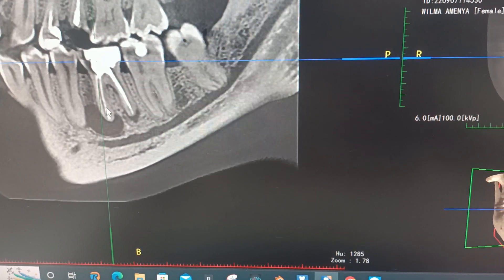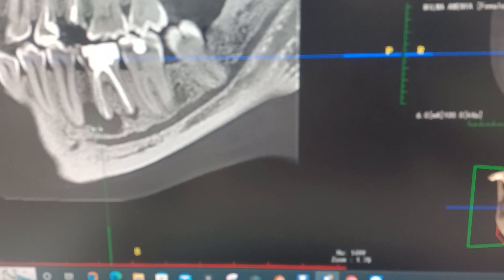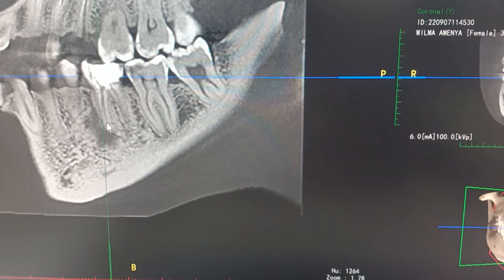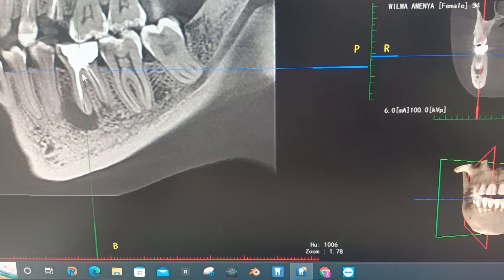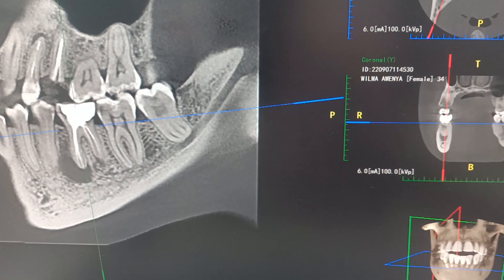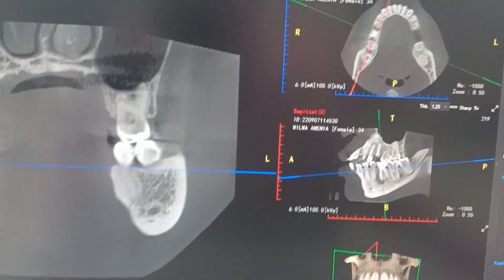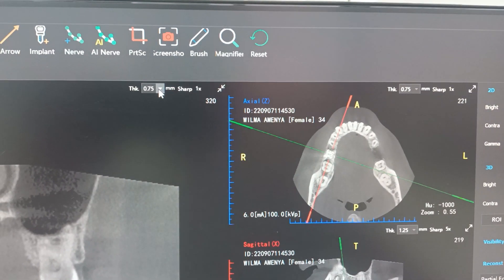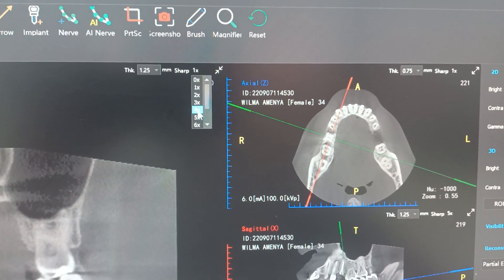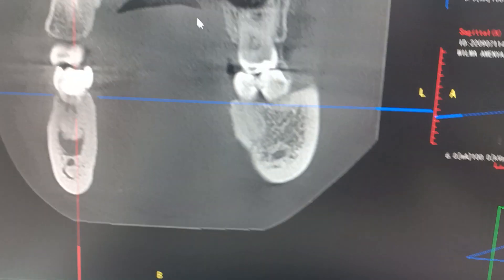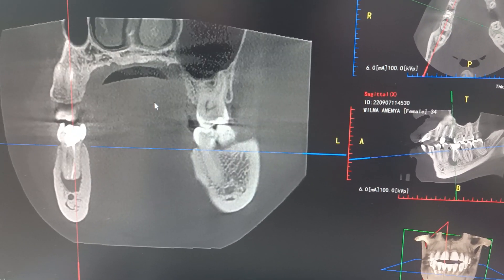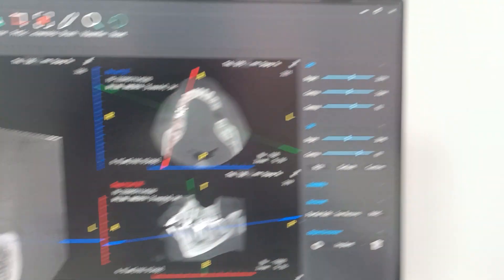We wanted to do an extraction of the 4.6. You can see there's a very large infection on the 4.6 area, which is here. You can align that, then come and click on the coronal view with the same settings — thickness 1.25, sharpness 5x. Now we can see the infection in its full state.